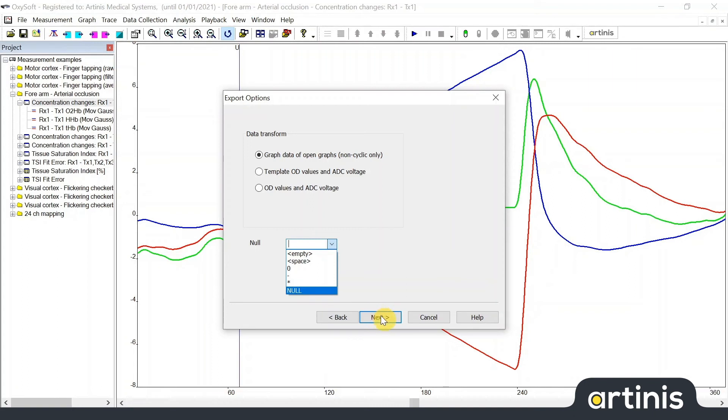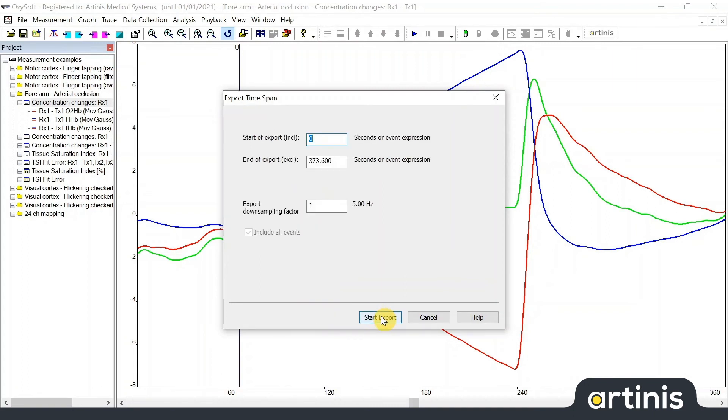In the last window before exporting your data you can specify the time span. You can set the start and end of the export either as time coordinate or by the letter relating to an event. Empty fields will select the whole data set at export.